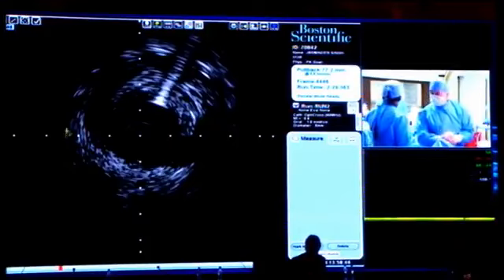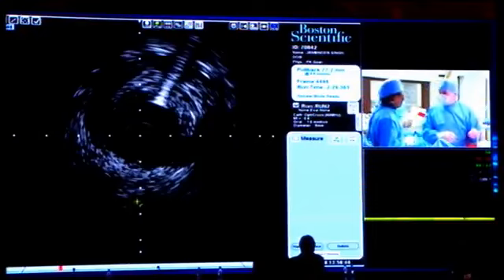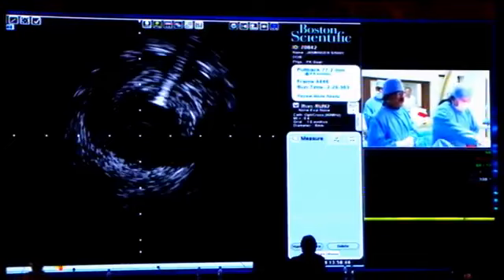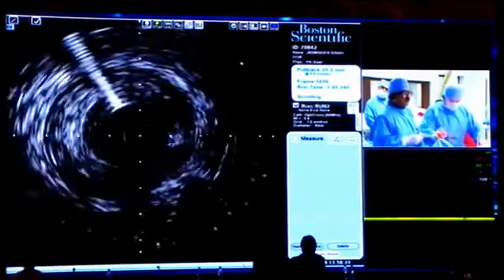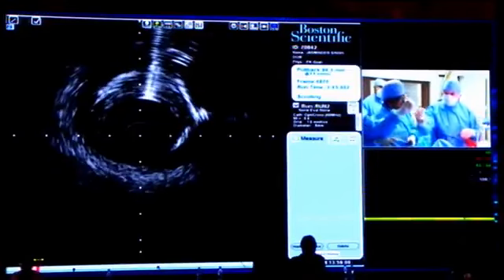The question is, will you bring the patient back for the circ, the distal circ? No, I don't think I will. This is a question which Dr. Werner has raised to me, but I am reasonably sure I will not get the patient back for circ, because the main branch has already come out, the big OM.